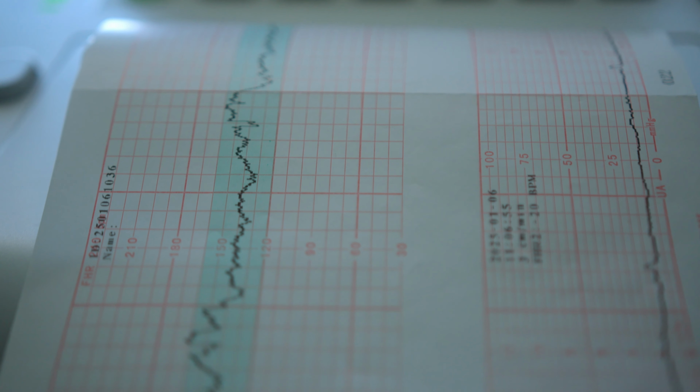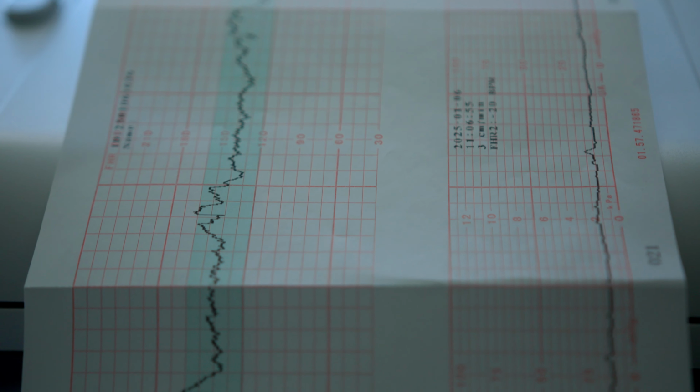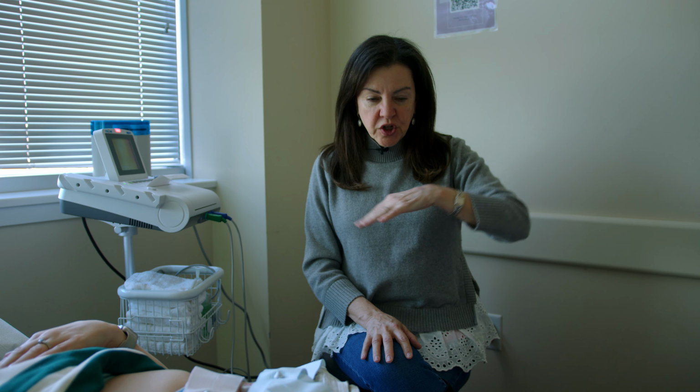We call this test a non-stress test because we're monitoring your baby when you're not in labor. It's not a very stressful time for babies, at least it's not supposed to be. And that means that we should see accelerations in the heart rate when your baby moves. A stress test would be labor, or sometimes we bring people in for a stress test if we're just not sure or we don't get enough information from our non-stress test. We induce a few contractions in you, and then we watch and see what happens with the baby's heart rate while you're contracting.